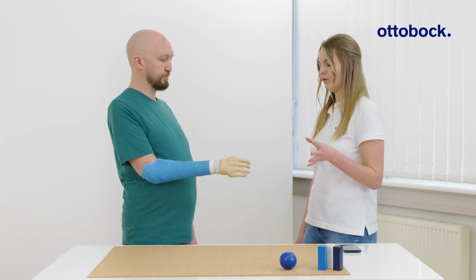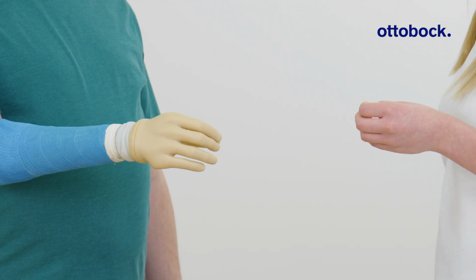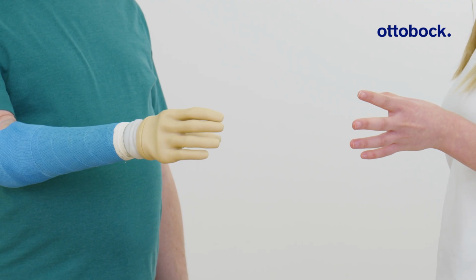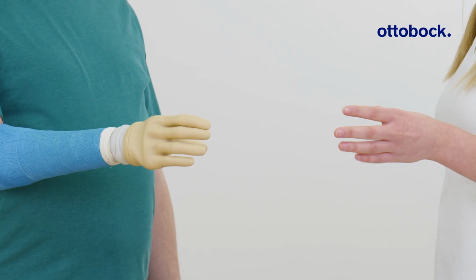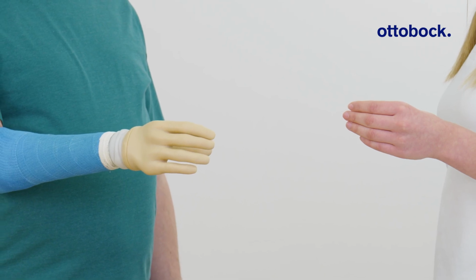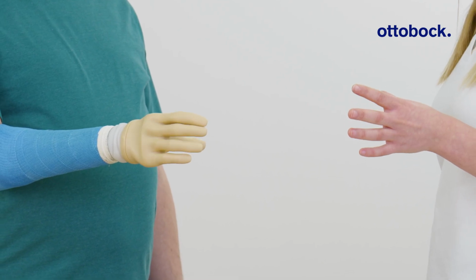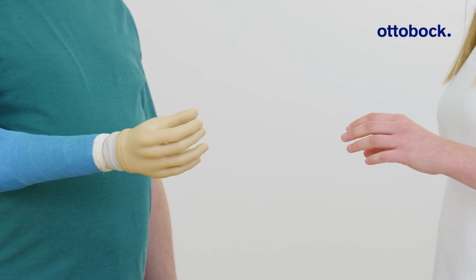Make variations of the exercise with switching rotation and hand, opening and closing quickly. Quickly opening and closing only halfway. Or rotating the hand at different speeds.